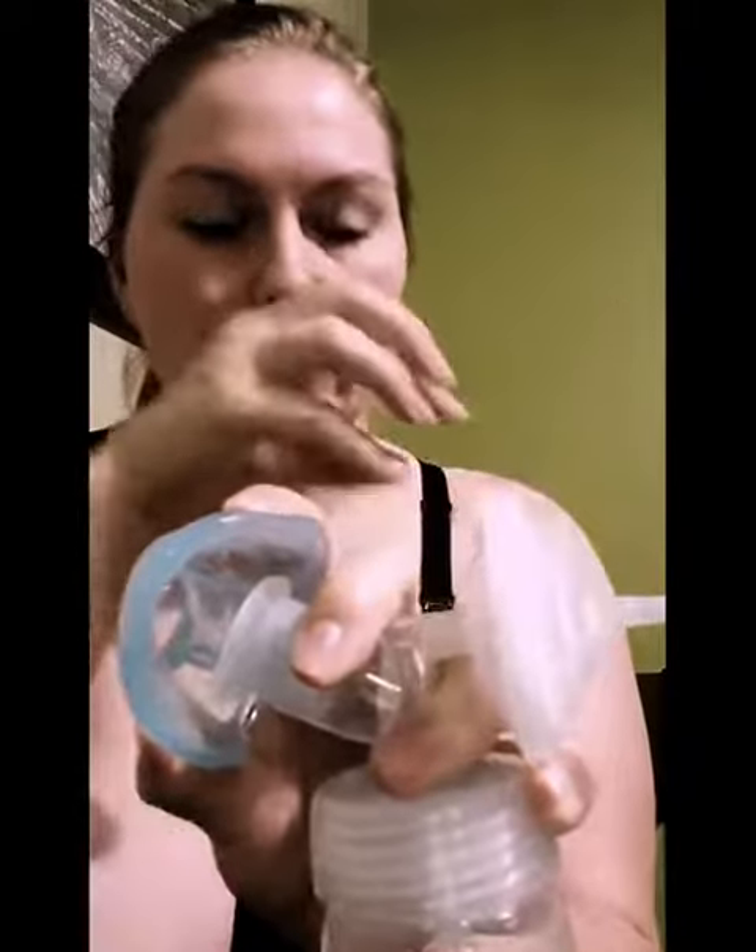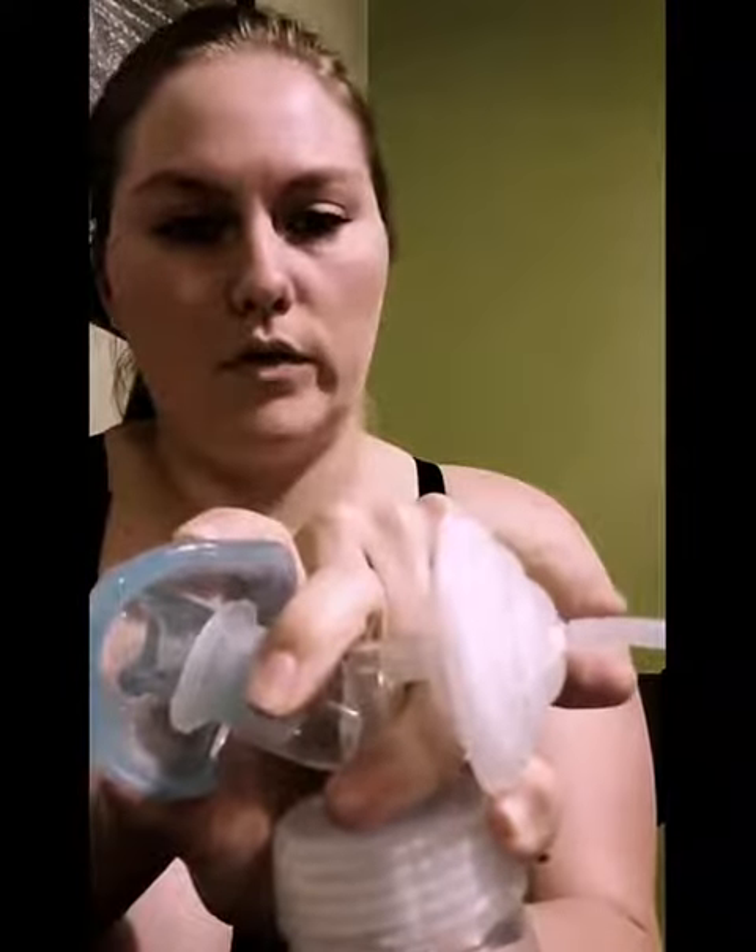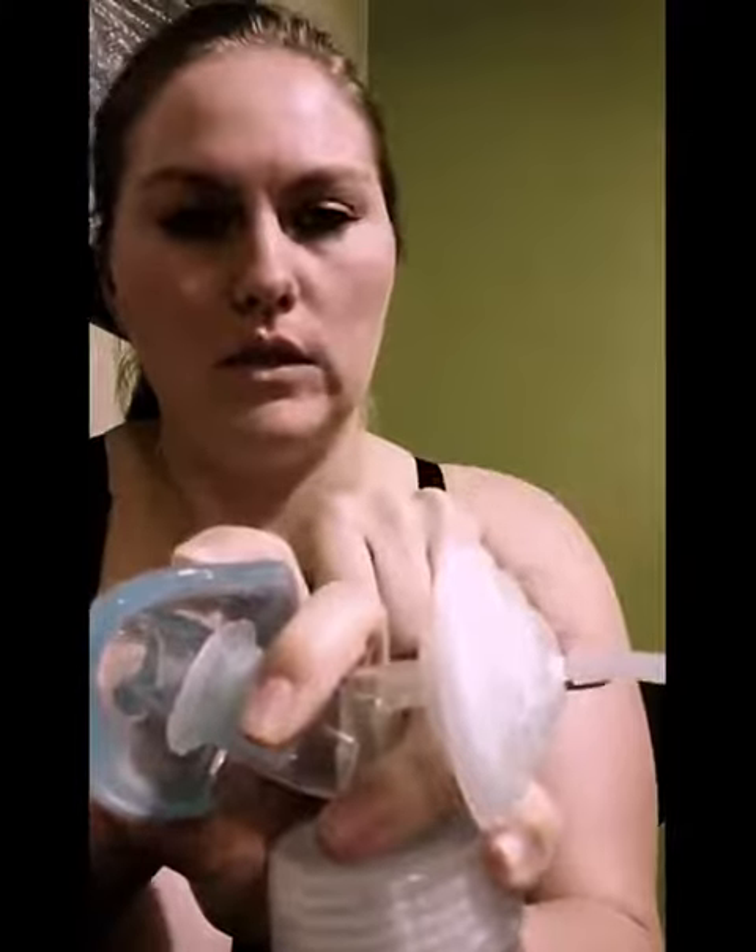You want to watch your backflow protector. When the pump actually suctions, it's going to pull the backflow towards the back. So that's important to pay attention to when you're doing this. You'll want to hold your breast and get into position.